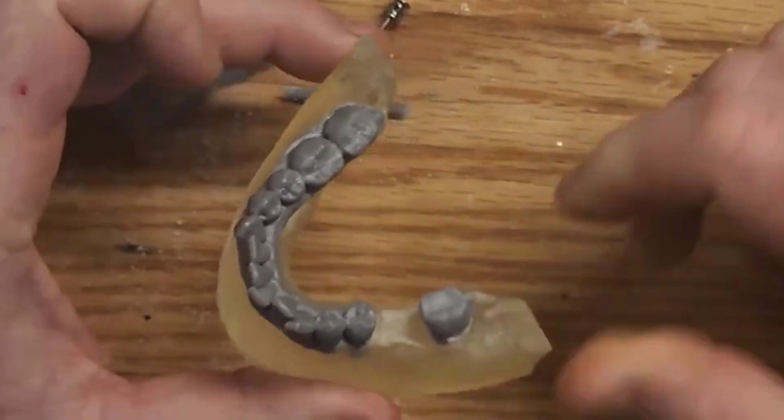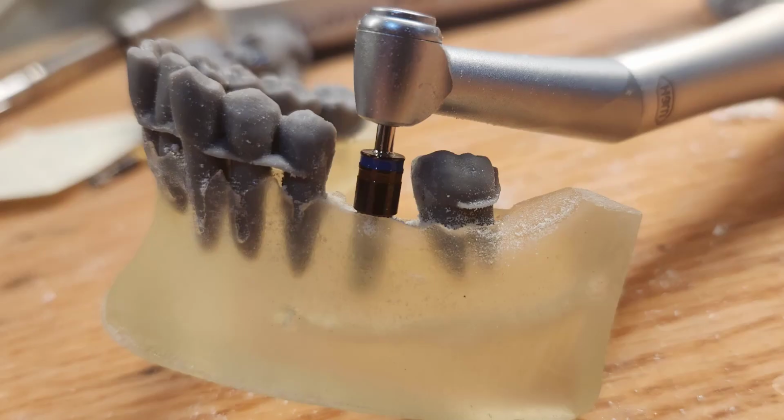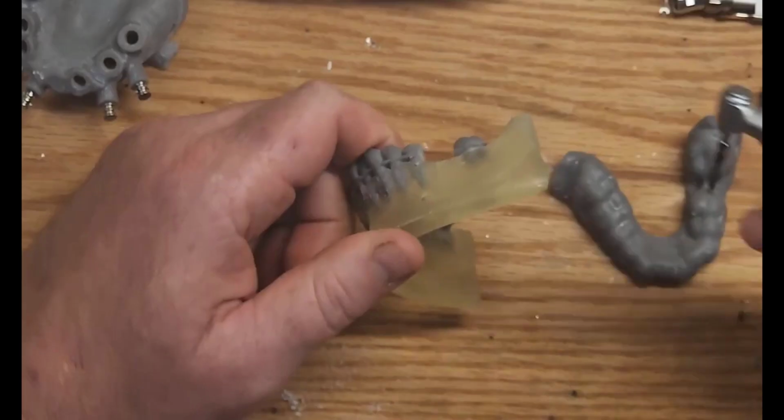So now you have a realistic, lifelike study jaw. It's got gingiva where there needs to be gingiva for the sake of seating your guide. You could treatment plan this just like it were a real patient, and now carry out your model-based surgery. So with that, let's go ahead and look at actually doing the drilling on this, because this was the first time I tried it. I wanted to make sure it was able to be drilled on without chewing up my burrs, and so we'll look at that.